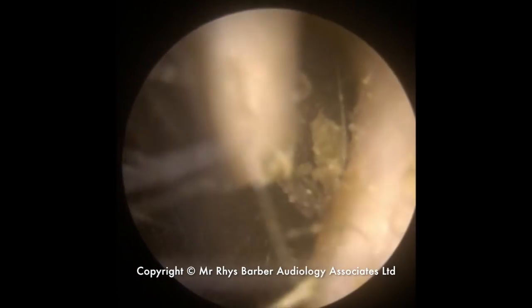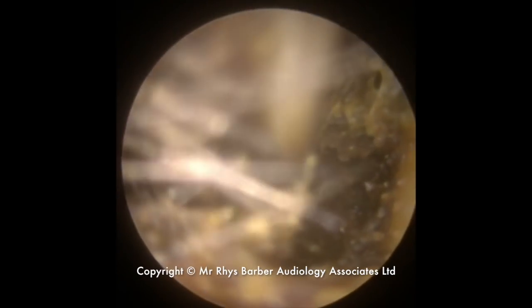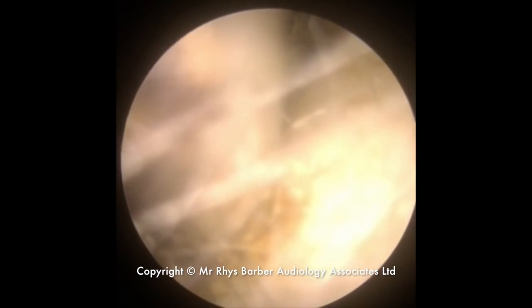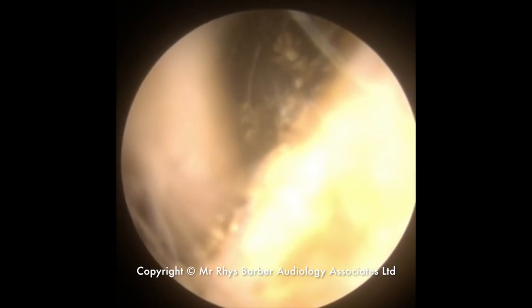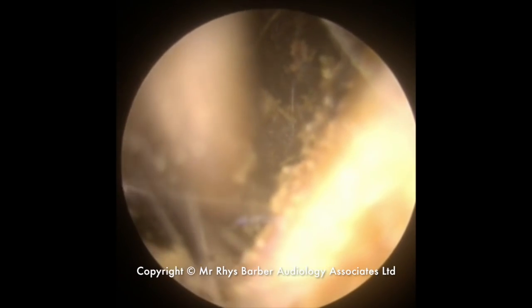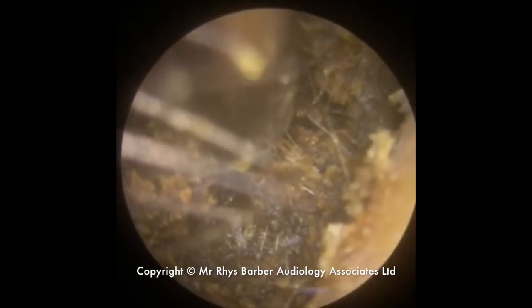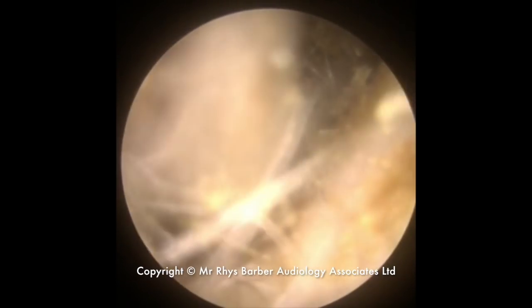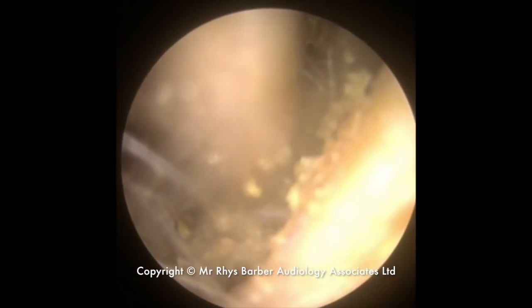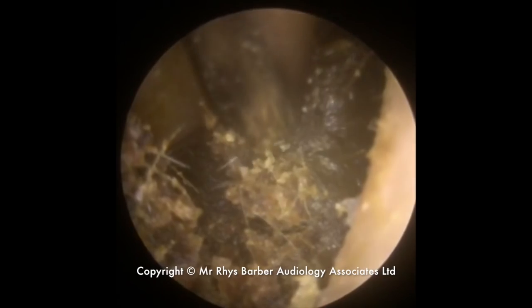You can see it just blocked up very quickly there. Just folding the wax in on itself. Because to take the wax away using the Jobson horn along the canal wall is quite uncomfortable — it feels like a mild scraping or mild pinching sensation. So that's why I opt to use the suction to pull the wax away from the canal walls, as it's more comfortable for the patient.